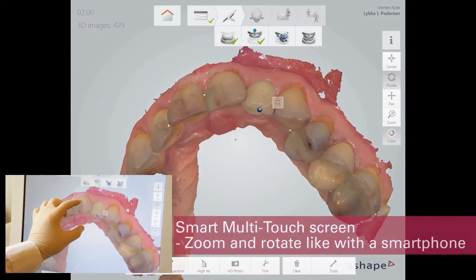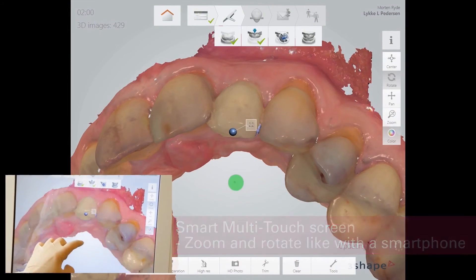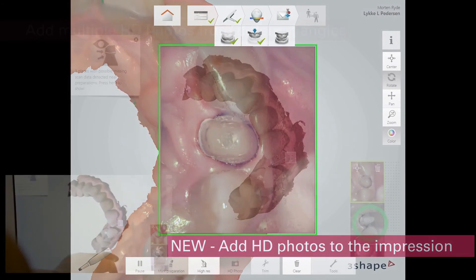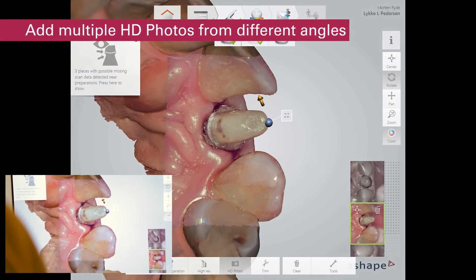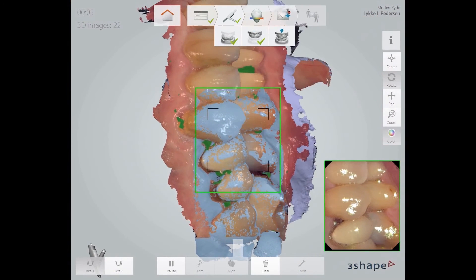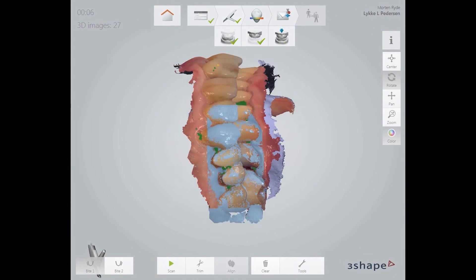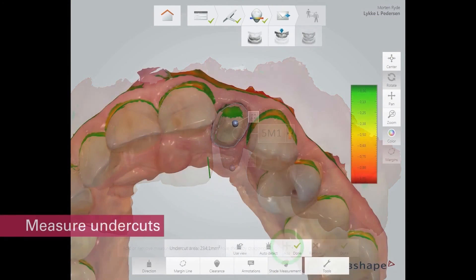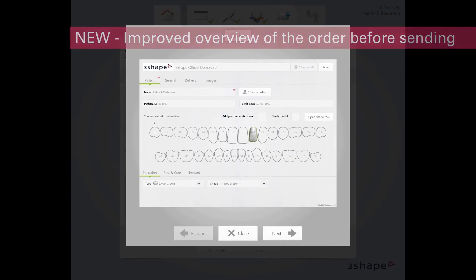Let's take a look at some of the latest enhancements to DentaSwiss by 3Shape TRIOS. Smart touch screen allows zoom and rotate functions. Take and include HD photos in the digital impression, with multiple photos from different angles for patient consultation, case documentation, and communication with the lab. Fast automatic bite alignment. Integrated shade measurement of tooth structure as well as from HD photos. Undercut measurement. Improved impression and order review before submission.